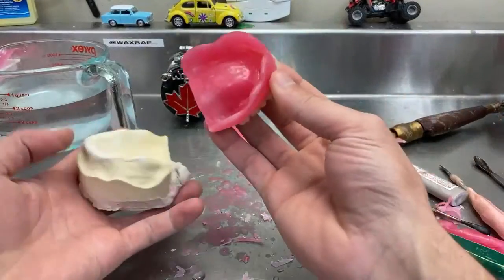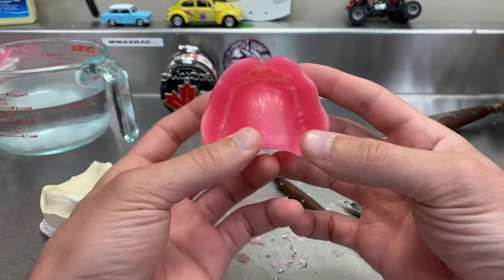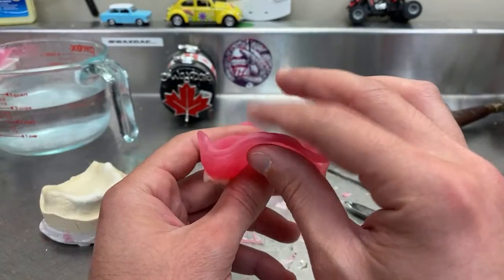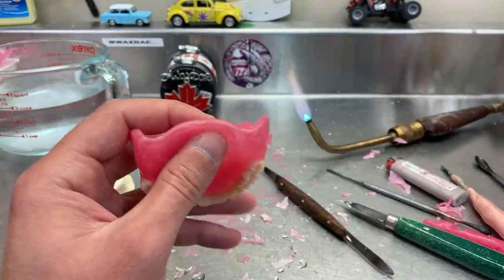Okay, so right now you see how I trimmed all of that here, trimmed the edges and the thickness here. I kept it the same. When it's in acrylic, I will try to get rid of some of that. But let's measure it.